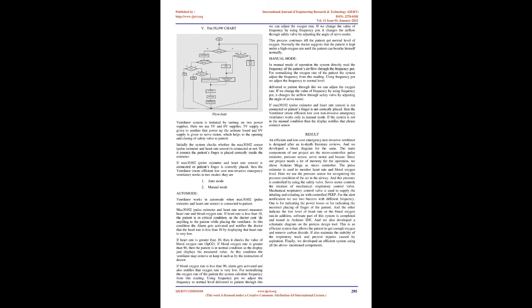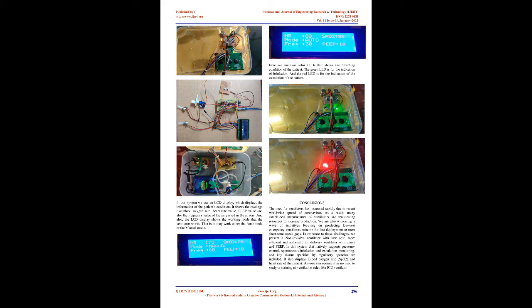Arduino LCD Interface. LCD is an output device, which helps to display all the measured readings and warning alerts. LCD is connected to the digital I/O pins, D0 to D21, of the Arduino. Here we connect D2, D3, D4, D5, D6 and D7 pins of Arduino to 12, 11, 8, 7, 6, and 5 pins of LCD.